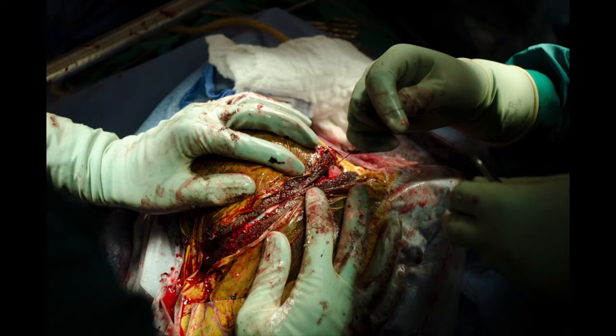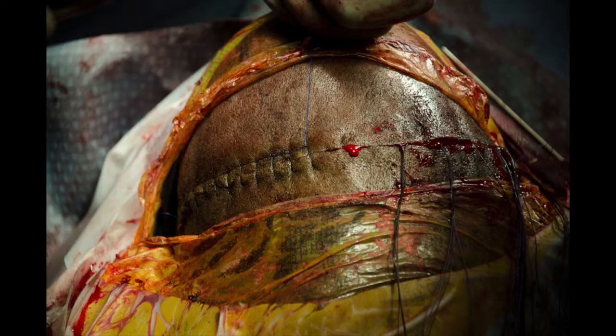The scalp is closed with 3.0 Vicryl stitches at the galeal level, and staples or non-absorbable suture to reapproximate the skin edges. The wound is properly dressed with Bacitracin ointment, sterile gauze, and a head wrap.